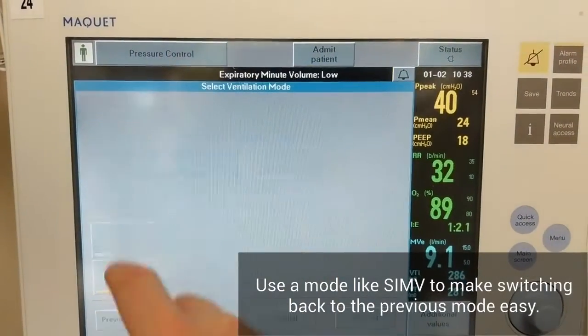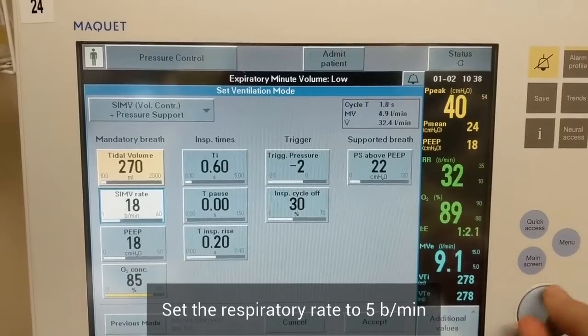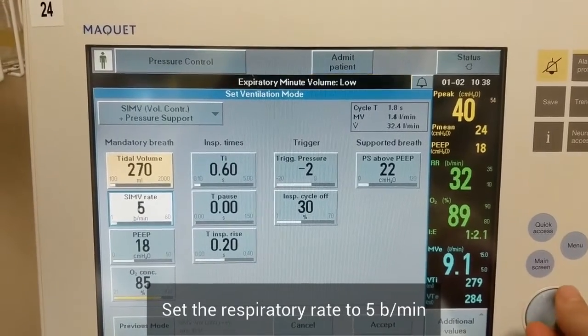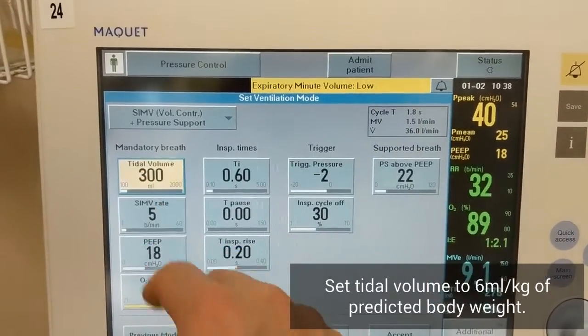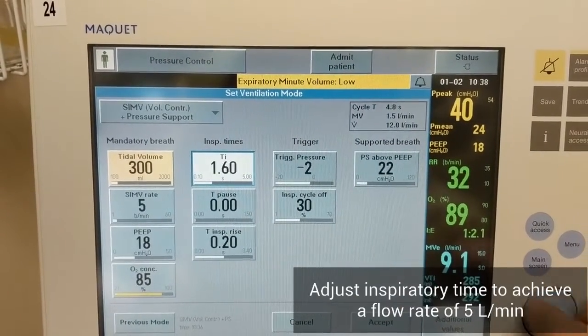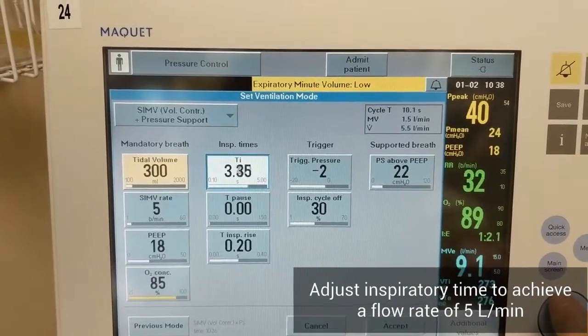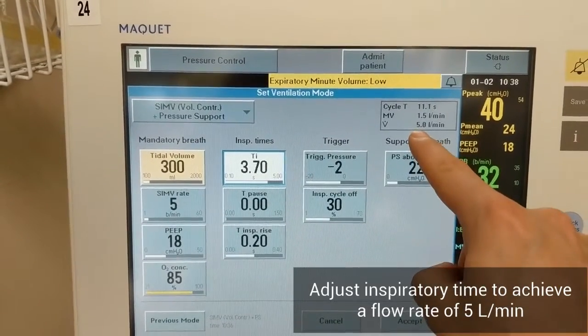To do a low flow inflation on the Servo-I, it's easiest to do it using another mode like SIMV volume control. Decrease the rate to 5 breaths per minute. Set the tidal volume to approximately 6 mls per kilo of predicted body weight. Increase the inspiratory time until your flow is 5 liters per minute. You can see this in the top right corner of the settings screen.